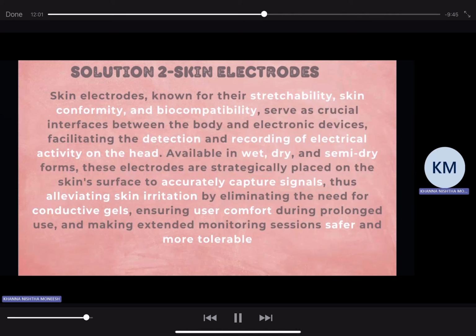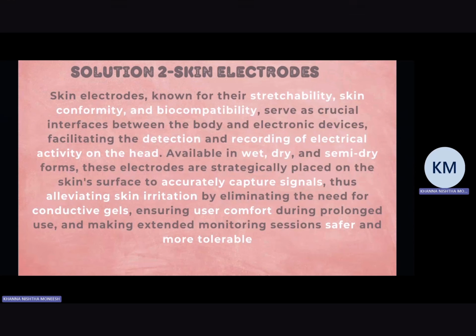They come available in wet, dry, and semi-dry forms. These electrodes are strategically placed on the skin surface to accurately capture signals, hence alleviating skin irritation by eliminating the need for conductive gels, ensuring user comfort, and making monitoring sessions safer and more tolerable.